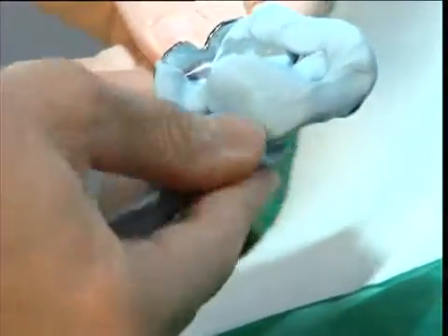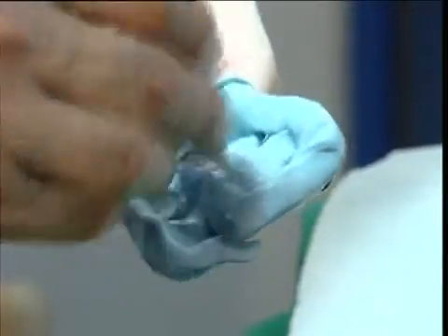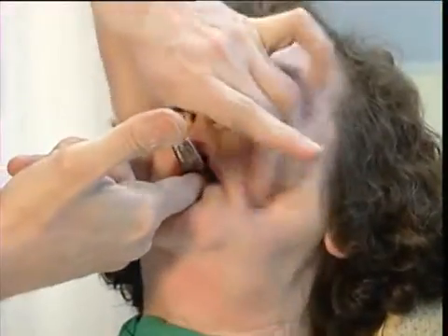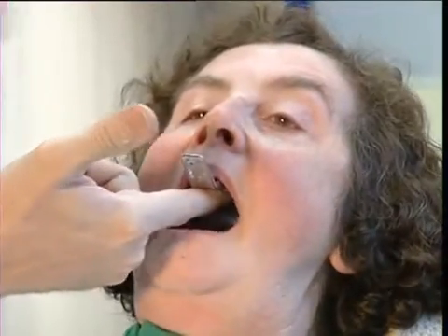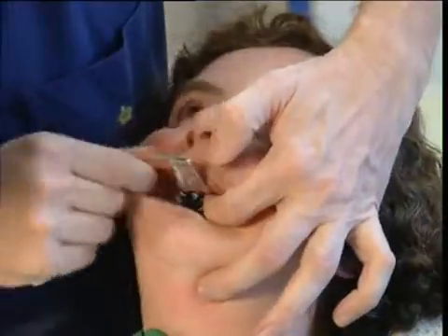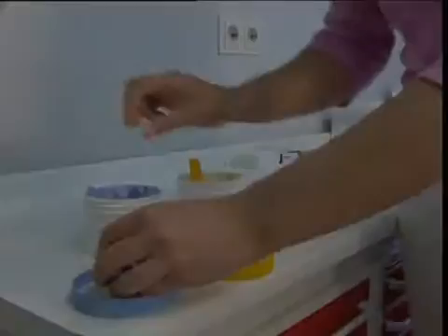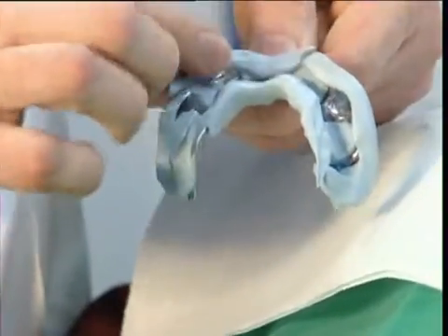During the next phase, a preliminary impression is taken of the vestibular fold, for which the tray peripheries are also coated with putty. While this is setting, the vestibule should be massaged and the patient requested to carry out excursions to form the soft tissues clearly. This procedure is also repeated for the mandible.